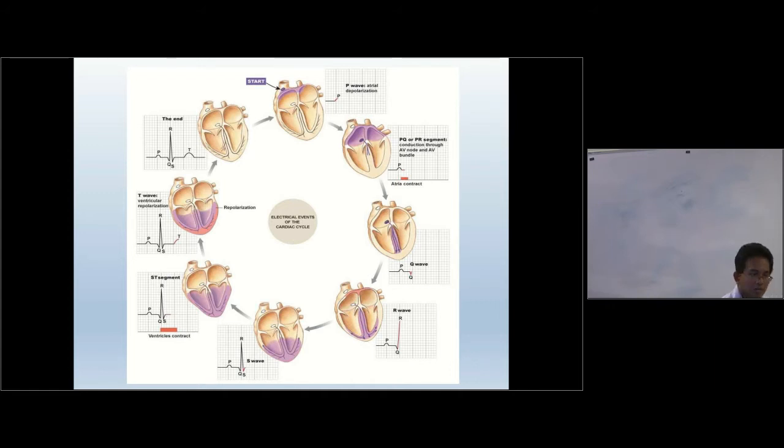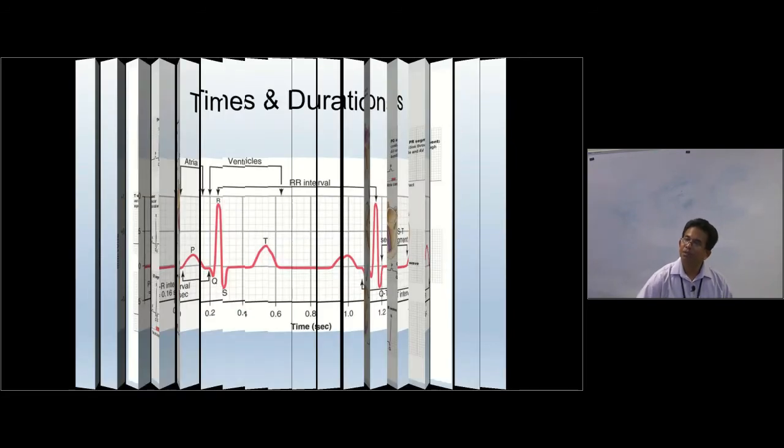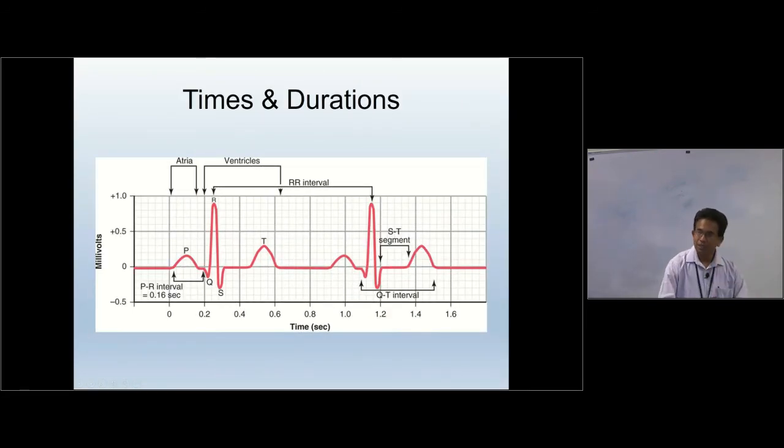They all depend on where the electrode is in relation to the heart. Some of the electrodes are a little bit far away. Some of the leads are at a right angle to the electrical axis. So that's why they all generate different shapes. Okay. So we'll discuss that in a minute. There are a few things we need to remember.